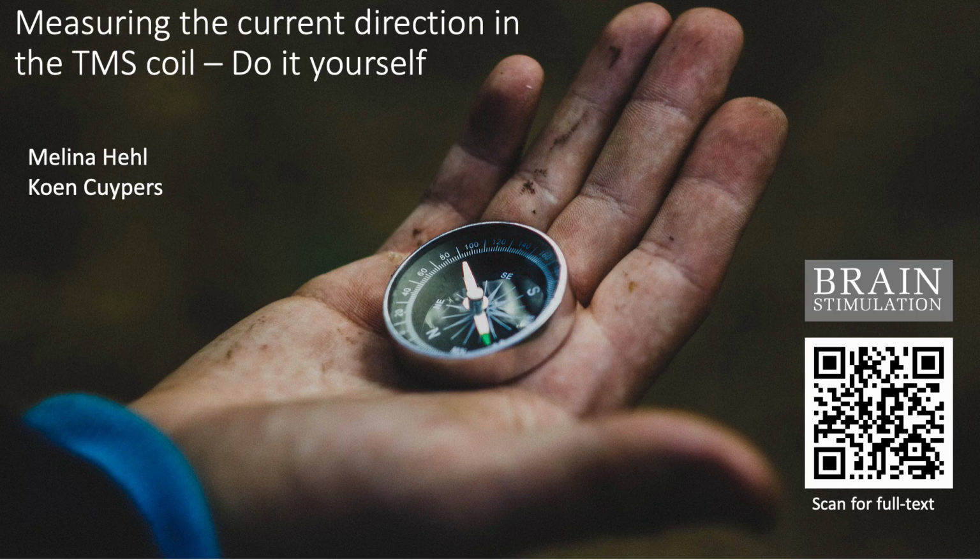Welcome to this short video in which we explain how you can validate the current direction in your TMS coils yourself.